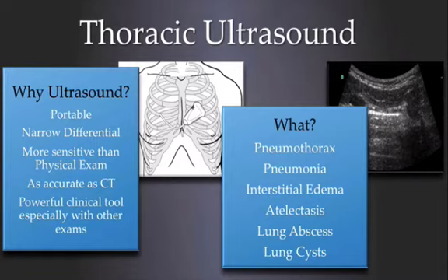Well, first off, ultrasound is portable, which means that it can be used in a wide variety of settings. It could be used in the ED at bedside, or it could be used out of the hospital in scenarios such as a disaster setting. Ultrasound is very good at eliminating differential diagnoses. So you usually start out with a large number of potential diagnoses in a patient that comes in with shortness of breath, and ultrasound can help eliminate these one by one, narrowing your differential.